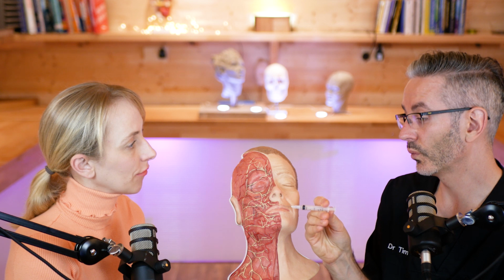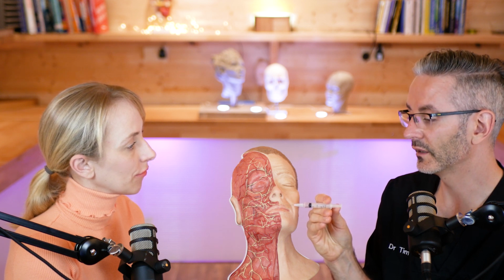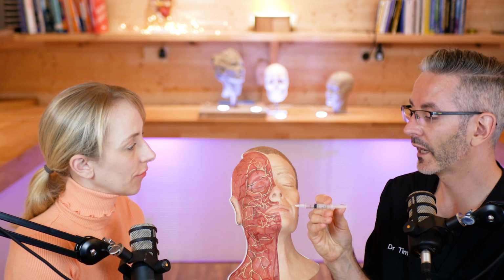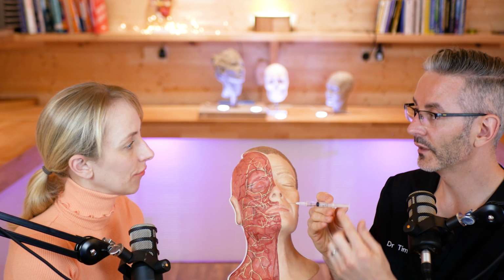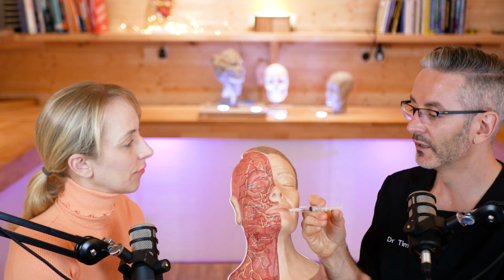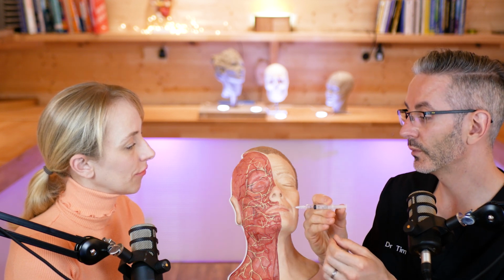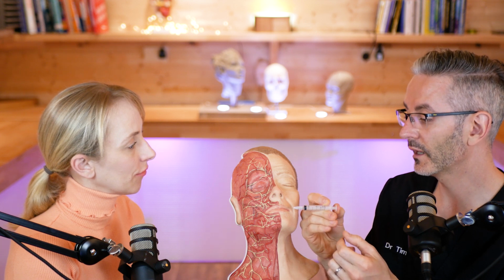The easiest way is with one hand. I mean, it's not actually the easiest way, but the principle is easiest to illustrate: if I'm pulling a thumb out from these fingers, the force that is opposing the thumb is the fingers, so that the net force is zero. I can't pull my hand apart. My thumb's not going to fly off in a different direction. So this is one way, that you aspirate in a way that makes the net force across the syringe zero. So using the same hand is one way to do that.